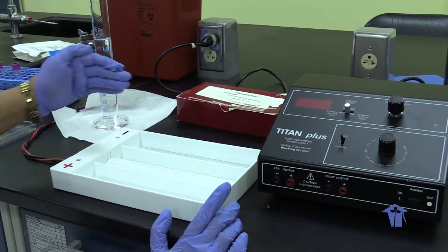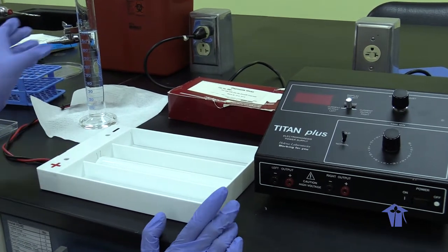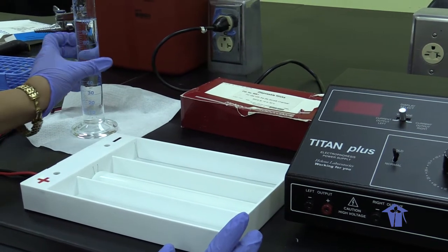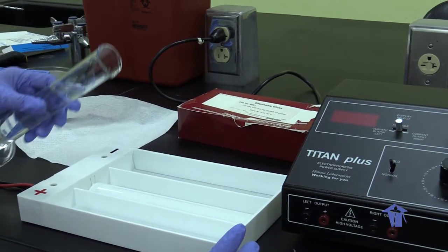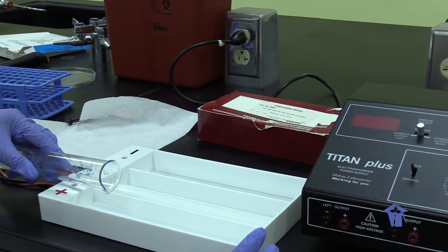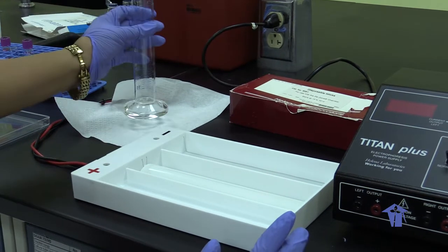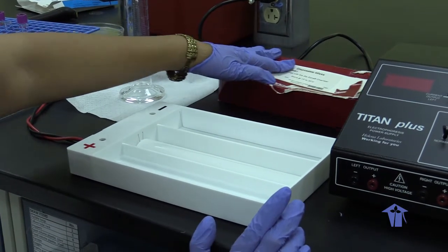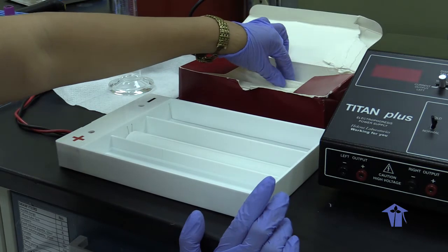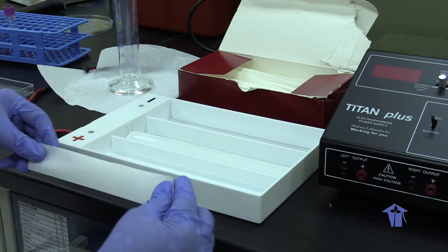The buffer goes to the outer chambers, and 100 milliliters of the buffer goes into both sides. I'll show you how the actual wicks are placed on one side. So we just have to repeat it to the other side.